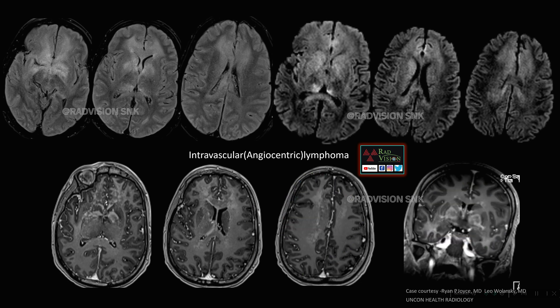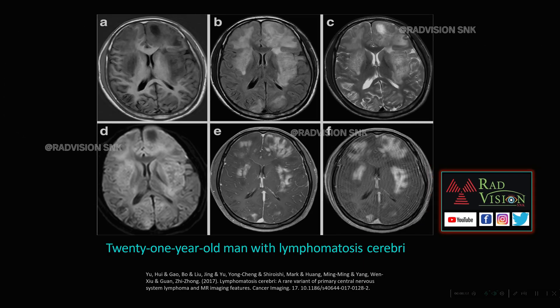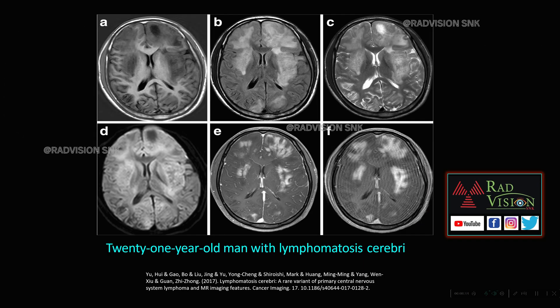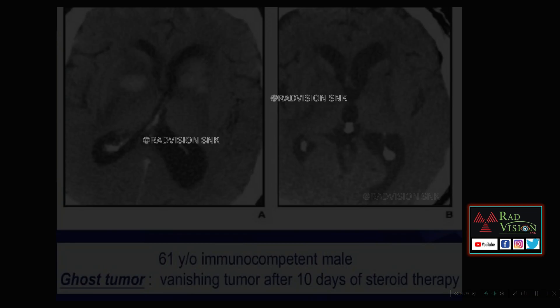Lymphomatosis cerebri: the lesion is hyperintense on FLAIR and T2, involving bilateral frontal, temporal, and even occipital lobes, showing intense heterogeneous enhancement more marked or prominent in delayed scans. This was a case of a 21-year-old with lymphomatosis cerebri, a variant of lymphoma.